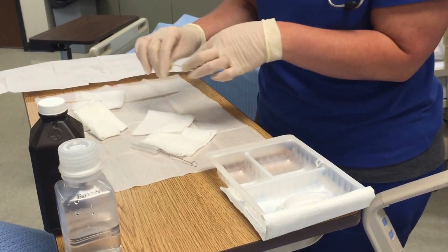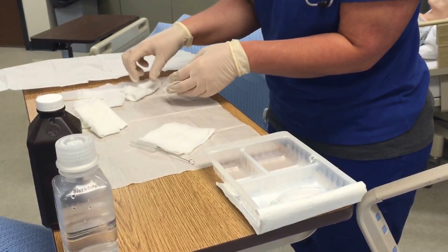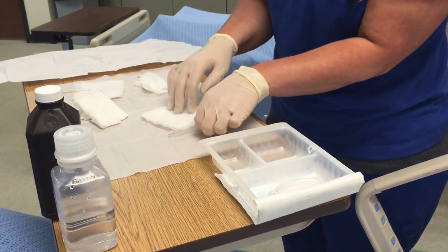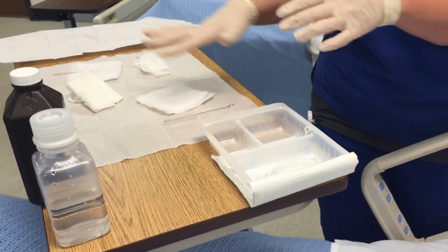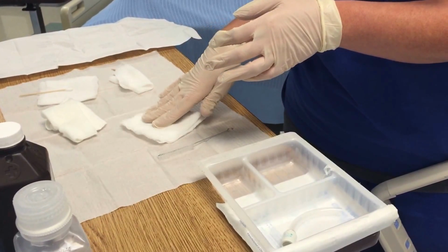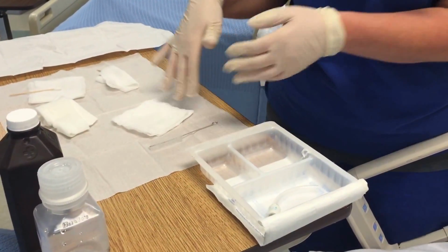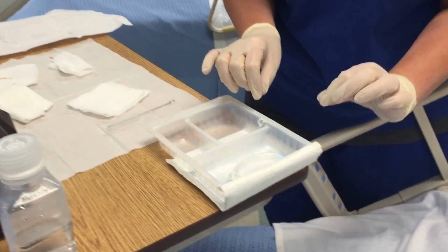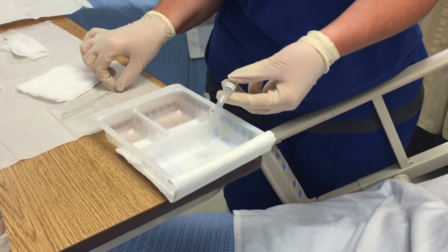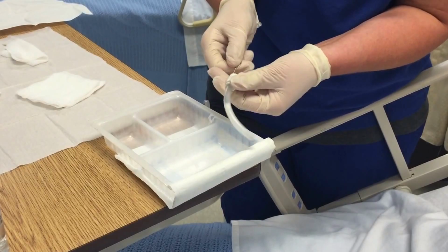Now, everybody has their own ways, but this is what we found is one of the easier ways to do it. So you can do whatever works. Now, when you actually work, you're going to be working like a clock. So I'm going to reach in, grab my tray, my inner cannula, and I'm going to clean, scrubby, scrubby.